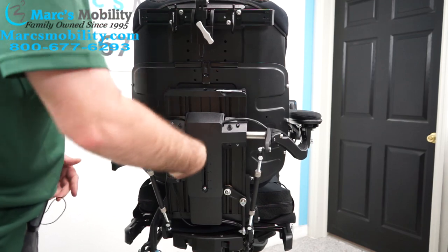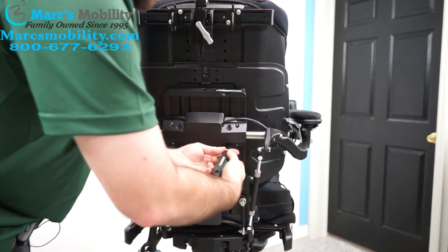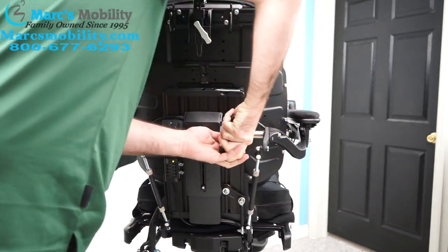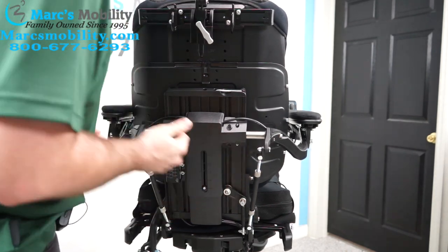This one is particularly tight — it might not be like this on your unit. Basically, you just need it until it breaks that. That should be loose enough to move it.